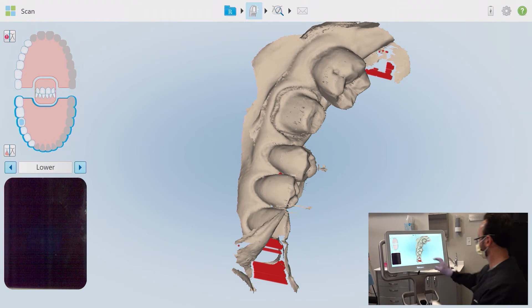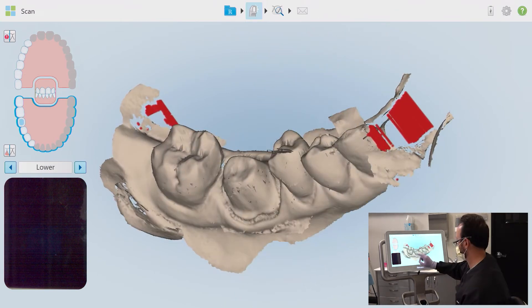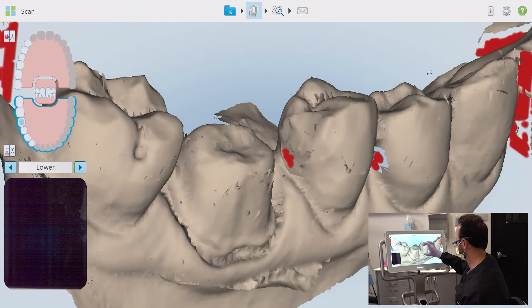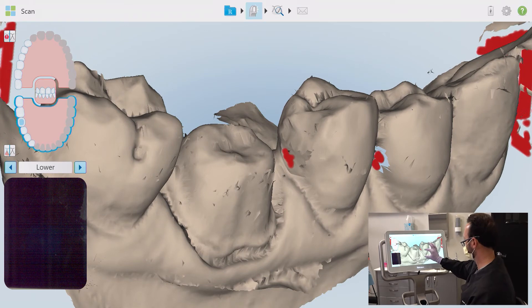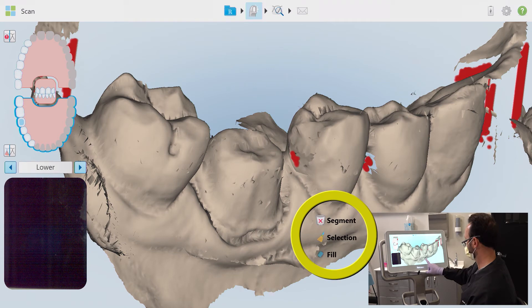I've stopped the scan at the buccal anterior and I'll visually review the complete scan and check for any missed areas. As I rotate here, I can see that the distal contacts of teeth 28 and 29 still need to be filled in. Since the iTero shoots at an incredible 6,000 frames per second, I only want to patch the missing data areas by using the fill feature.